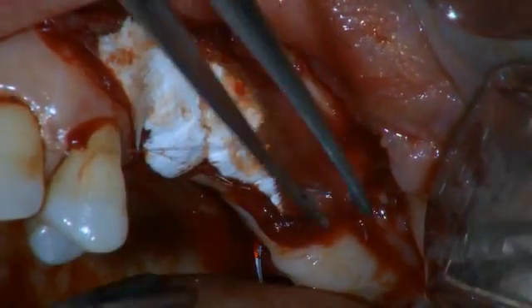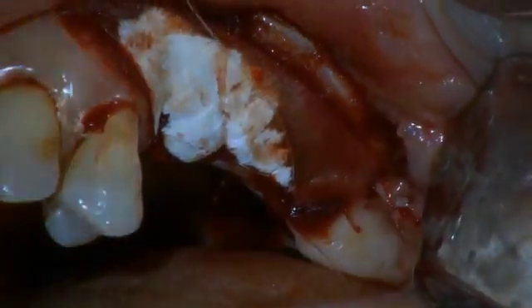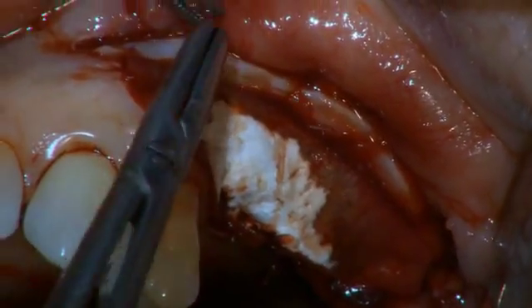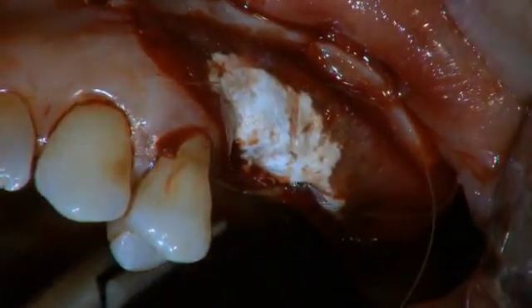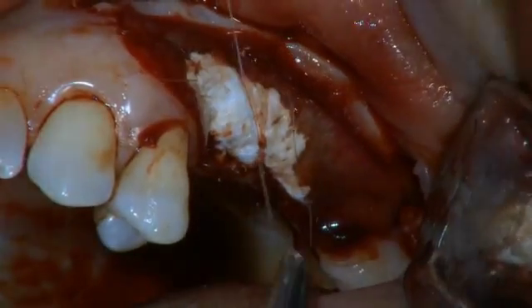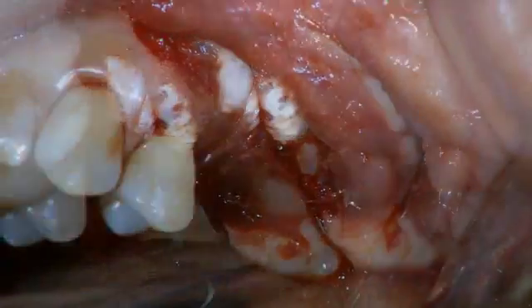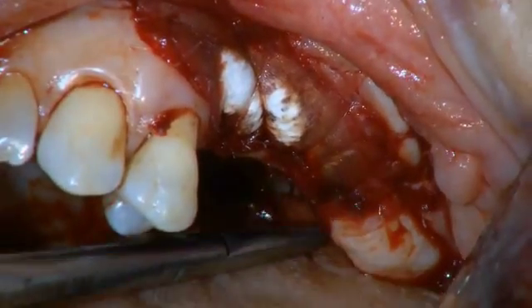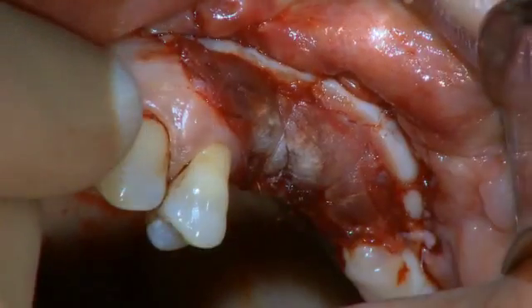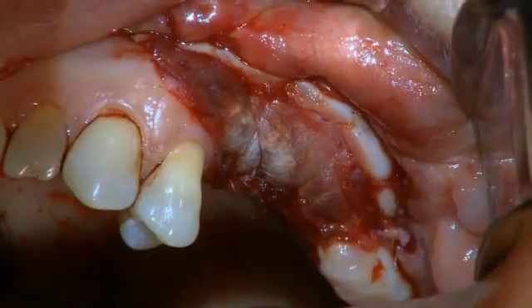The matrix readily adapts to the bed and is held in place with cross-mattress sutures. Here we are using 6.0 PDS-2 resorbable sutures. Another cross-mattress is added, so 3 cross-mattresses are holding this matrix in place. As you can see here, everything is stable and well adapted to the bed of the host tissue.